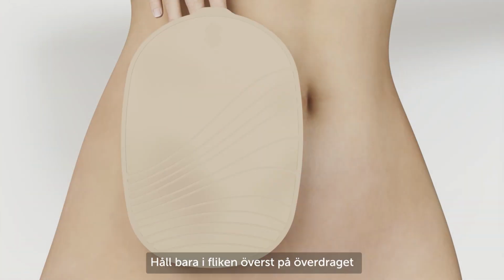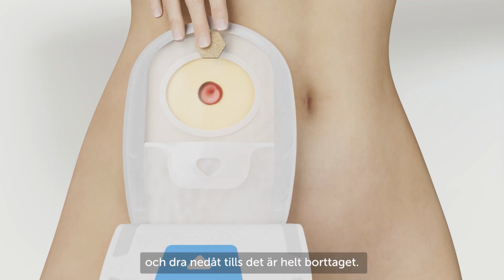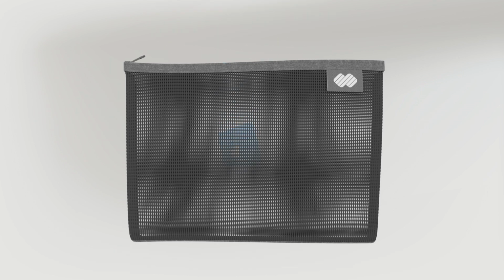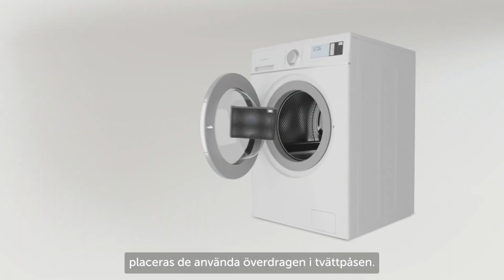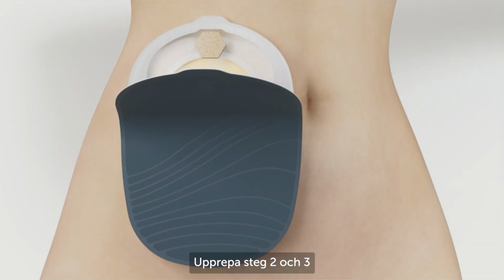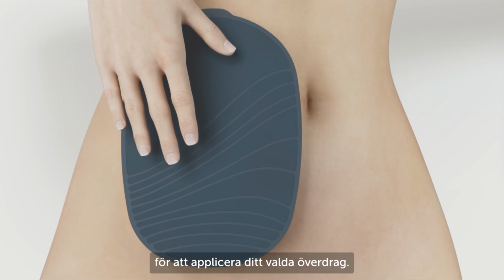Simply hold the cover release tab at the top of the bag and pull down until completely removed. The cover can be hand or machine washed. To machine wash, place the removed cover into the washing machine bag. Repeat steps 2 and 3 to apply your chosen cover.